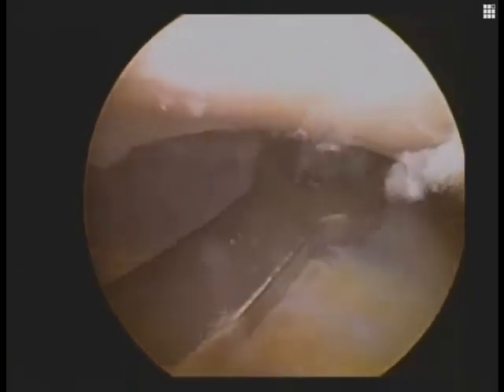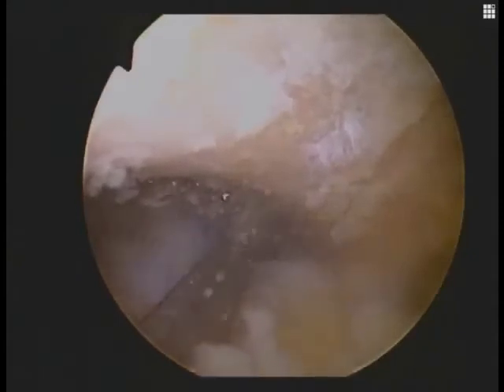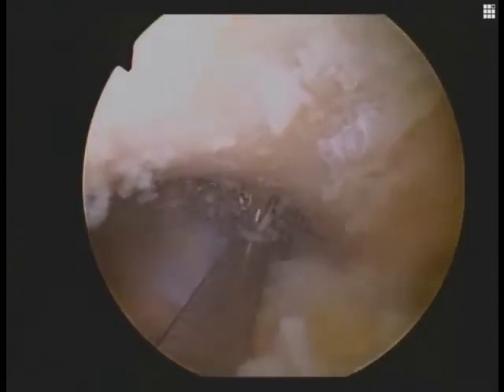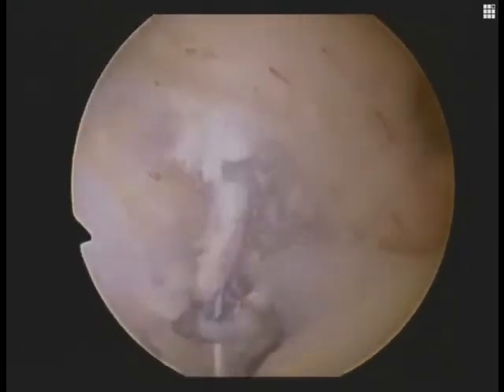The anatomical location is approximately three and a half centimeters medial to the AC joint and distal clavicle. We over-ream with a six millimeter cannulated reamer, then remove the central drill, leaving our cannulated reamer in place.